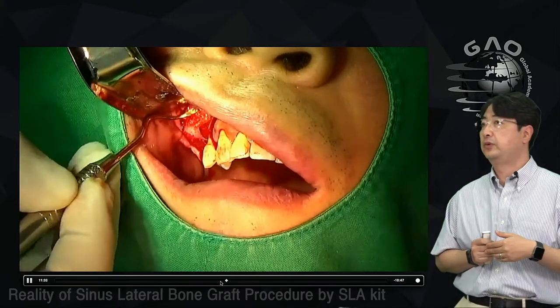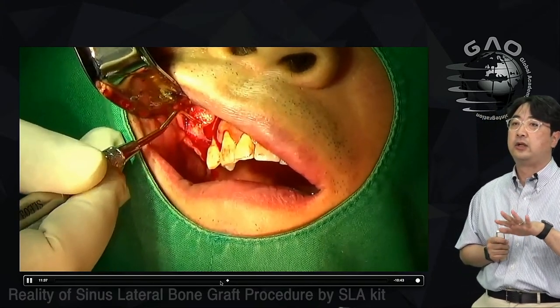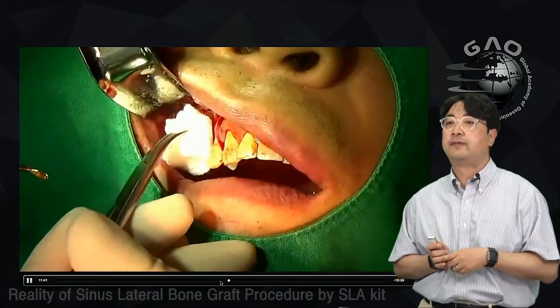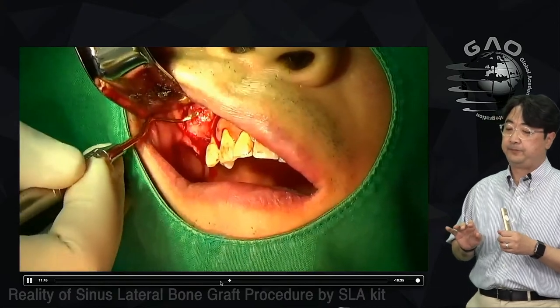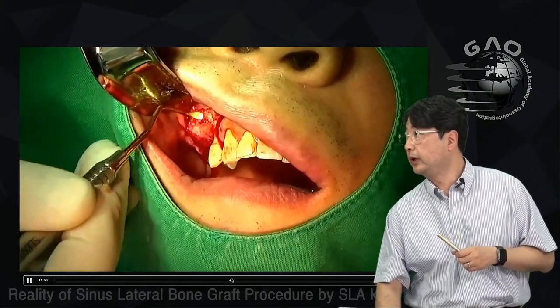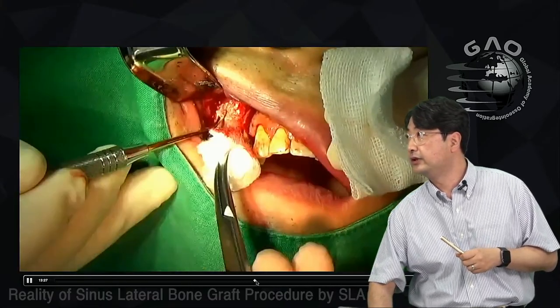So I do it very carefully. I'm using the freer elevator to locate the bone graft. And as I told you before, I do distal first, then I go mesial, then I put in the middle part. Okay, so this is what I do. Okay, so repeating the bone graft procedures like this.